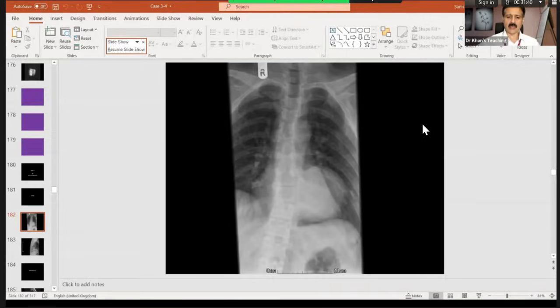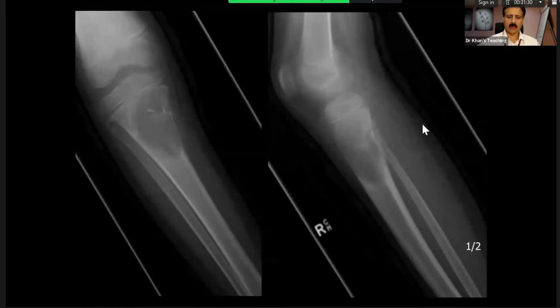Okay, I will again go into the spot diagnosis, please.